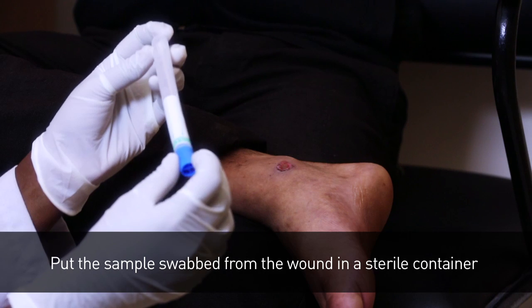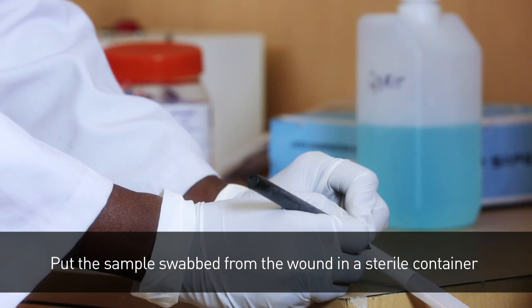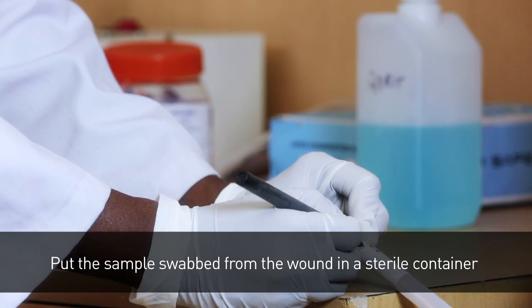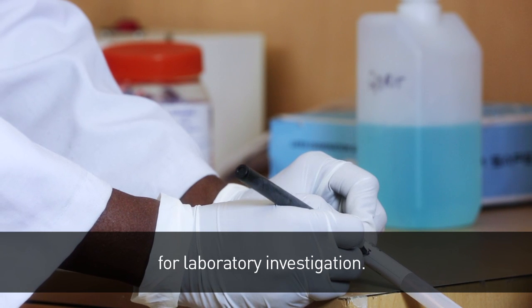Put the sample swabbed from the wound in a sterile container for laboratory investigation.